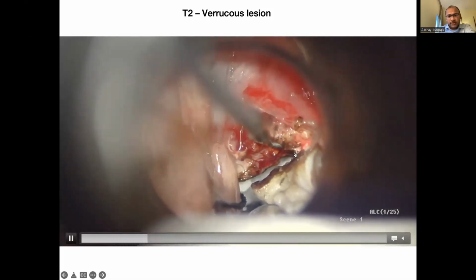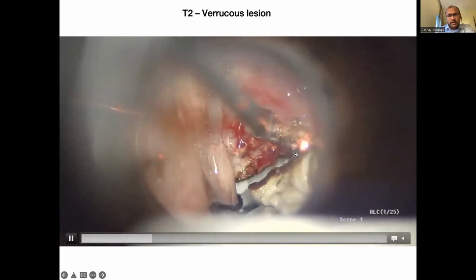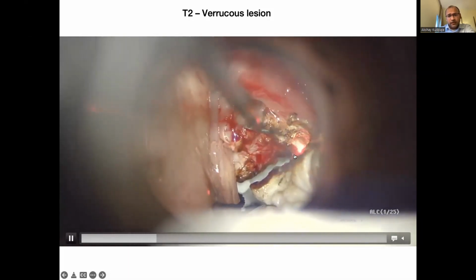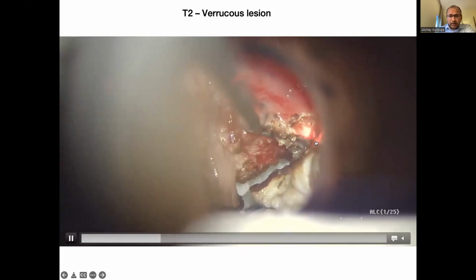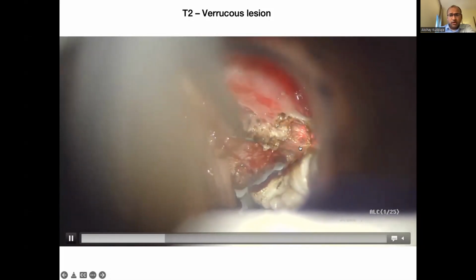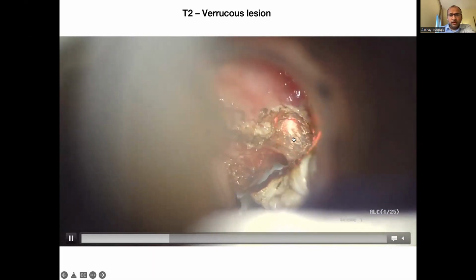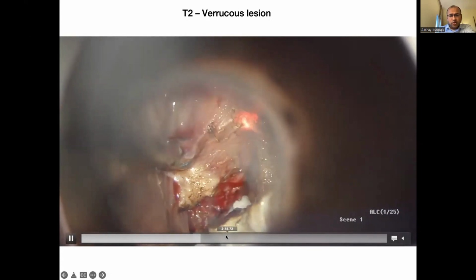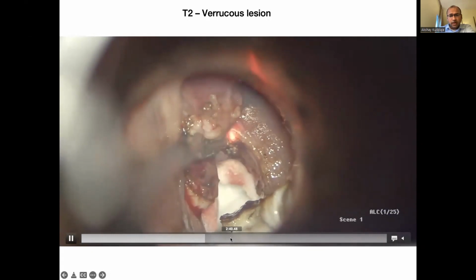So the tumor was extending up to the vocal ligament. Part of the vocalis muscle was resected in this. So the initial part involved resection of the anterior part of the lesion. Once we ascertained the depth, which is tumor free, part of the vocalis muscle was removed. And once we got the tumor-free region, we went around the tumor right up to the anterior commissure, and got the subglottic anterior commissure margin.